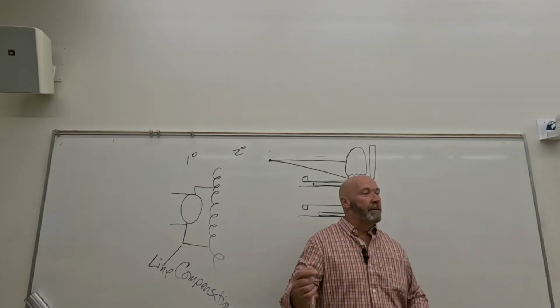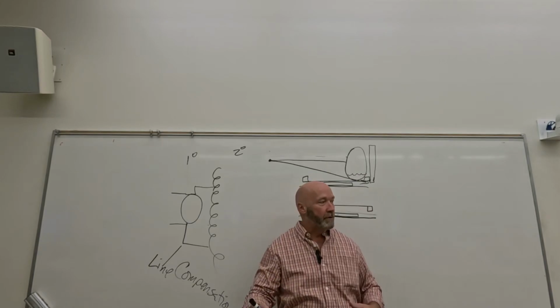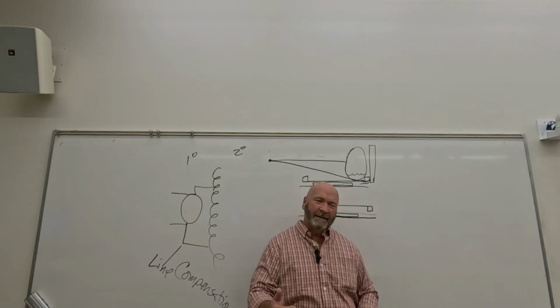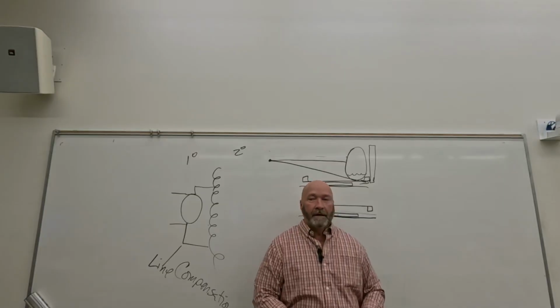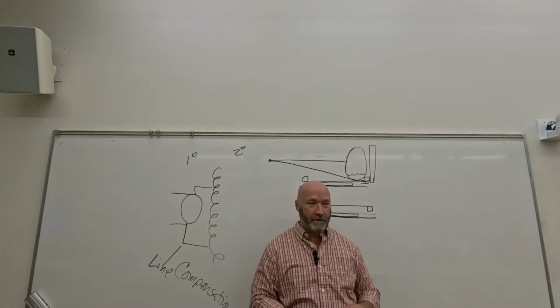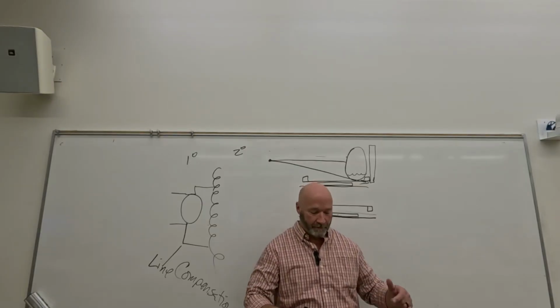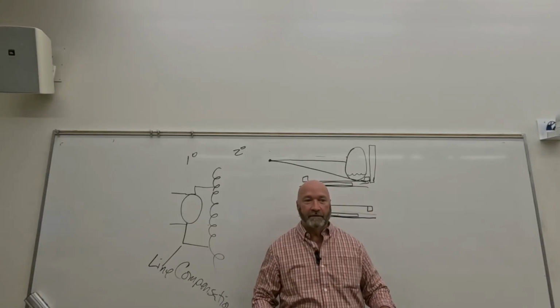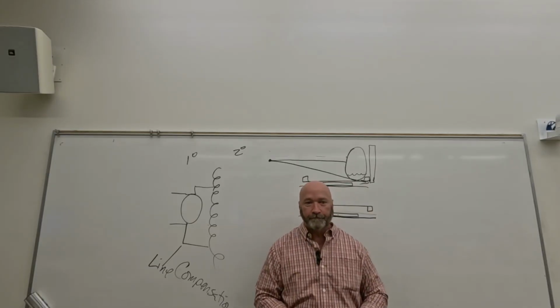So those are your motor driven. Again, fluoroscopy rooms, if it's fluoro, it's going to be motor driven. It's going to be slower, but it's much more stable. Most of the time, if you're doing a cervical myelogram, it looks pretty awful. You're going to put the patient in boots, and strap those boots to the footboard on the table.